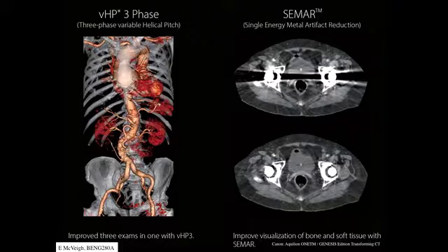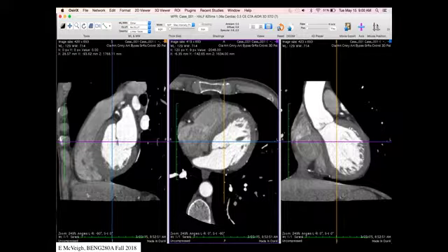So for surgical planning, data like this, where you have full three-dimensional, high-resolution representation of the anatomy, is exceptionally useful, right? And this has led to the use of CT in many, many instances. Virtually 50% of people that come into a hospital probably get a CT scan, right? Because it's so fast and quick and the images are so beautiful.